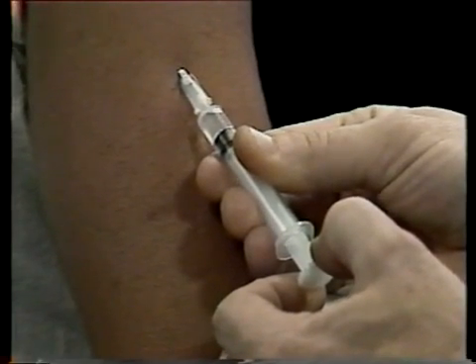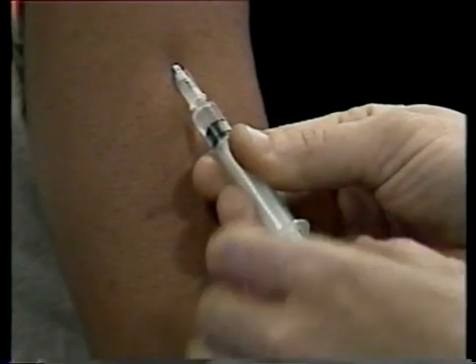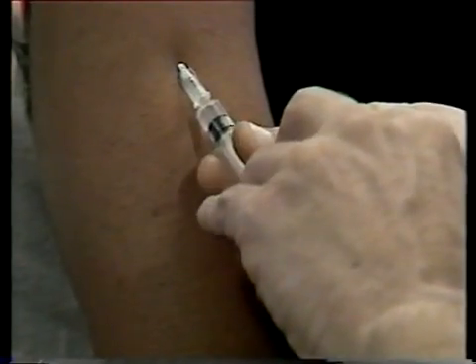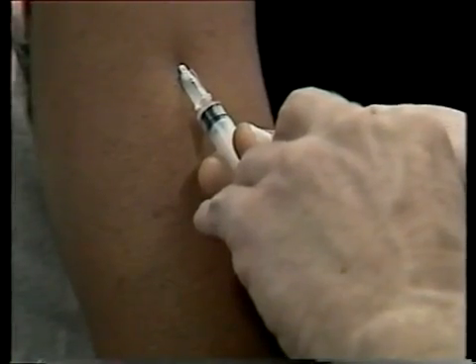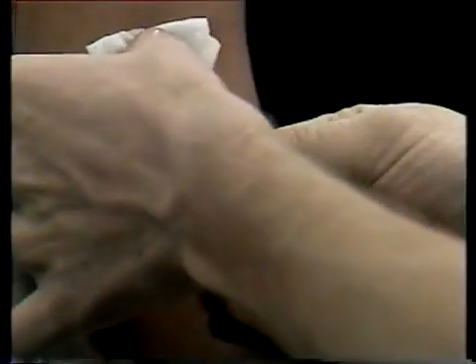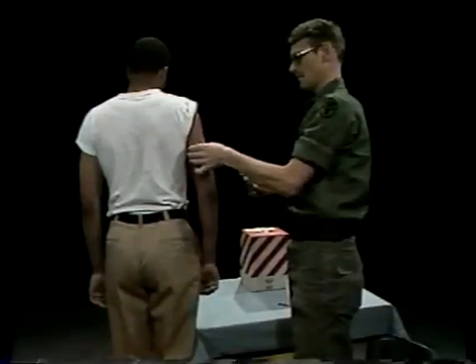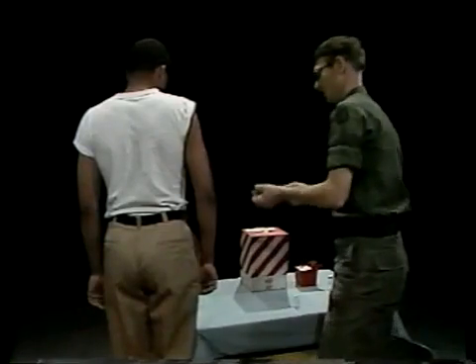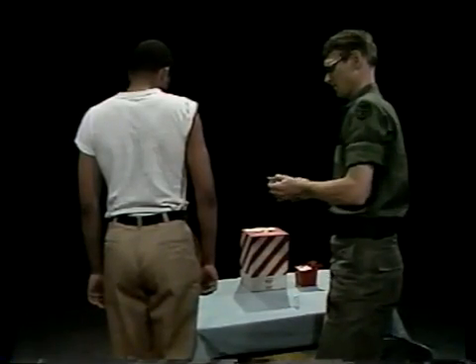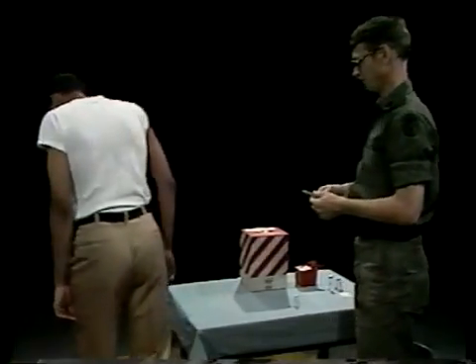If no blood appears in the syringe when you aspirate, press the plunger into the barrel slowly and steadily until all the medication is injected. Then put an alcohol sponge over the site and quickly remove the needle. Massage the site with the antiseptic sponge using a gentle circular motion to help disperse the medication throughout the tissue so that it will absorb readily.